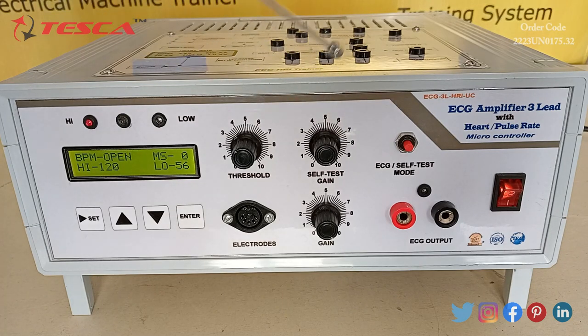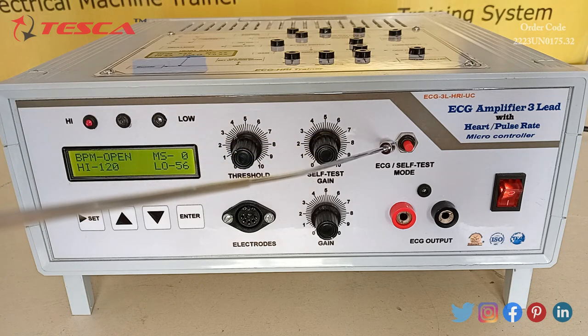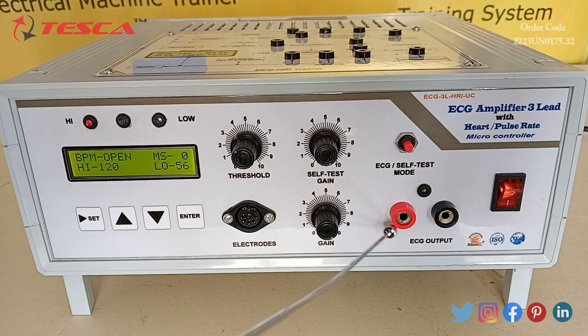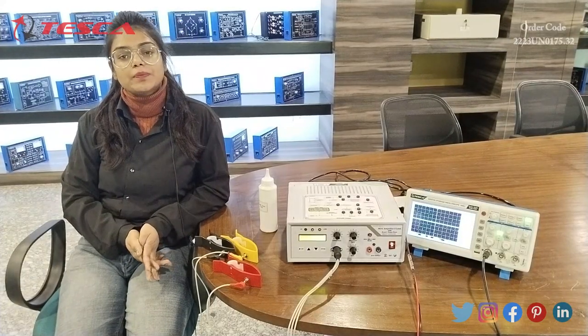This is the self-test gain switch and this is the gain switch, through which the gain can be increased or decreased. Here we can connect the electrodes. This is the self-test mode switch, and on this ECG output we can connect the DSO channel.